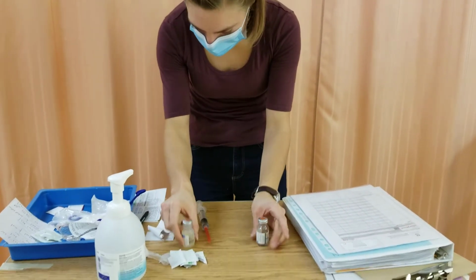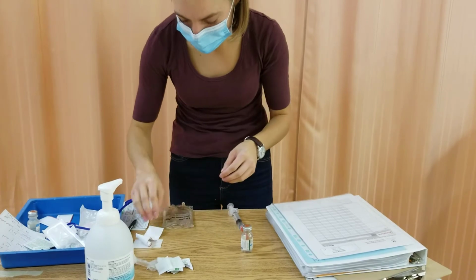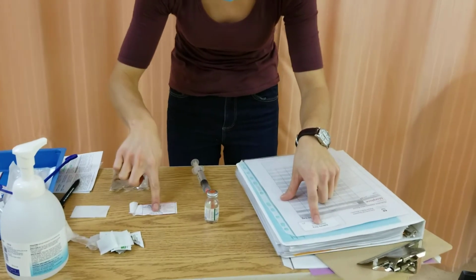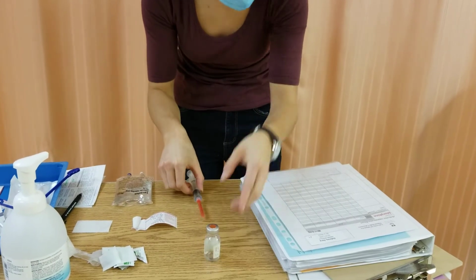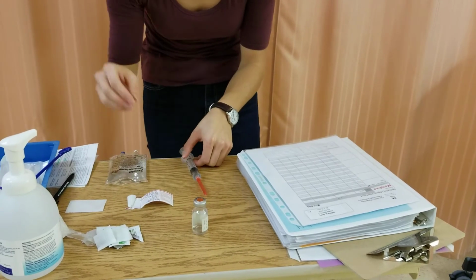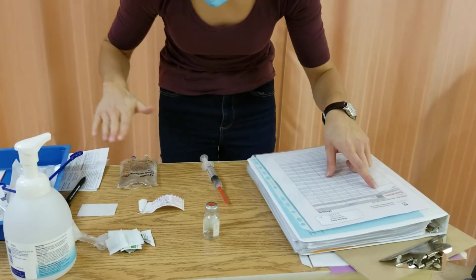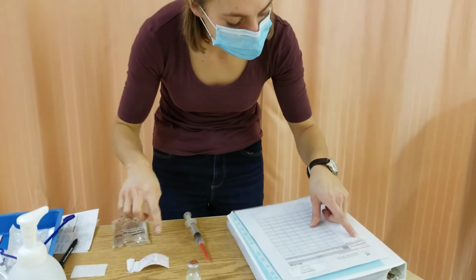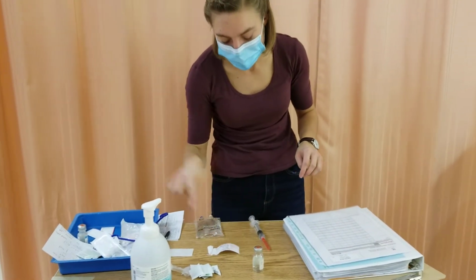So now I've got my medication, my bag, I've got my 50 ml normal saline that I'm going to administer over 15 minutes, and my label. I'm going to do my second check. So for Dore Dabney, Ampicillin, Ampicillin, and that's what's in here. 1 gram, so 1,000 milligrams. There's 250 milligrams per mil after reconstituting, so that's 4 mils, and there's 4 mils in here. And I'm giving it IV via mini bag, 50 ml normal saline for a total volume of 54 mils. And every 4 hours, the time right now is 5:45, it's due at 6 o'clock, so I'll be giving this medication now. And I wrote down here 5:45.